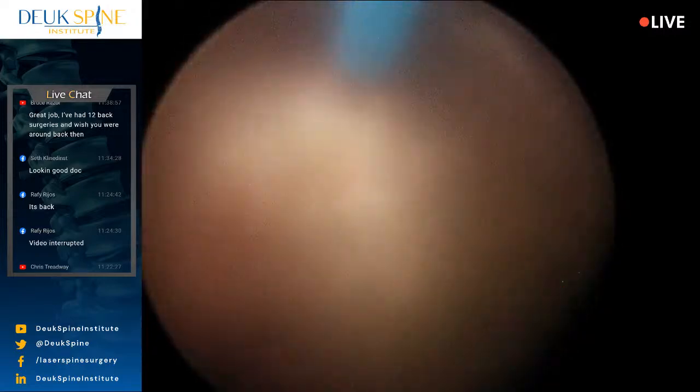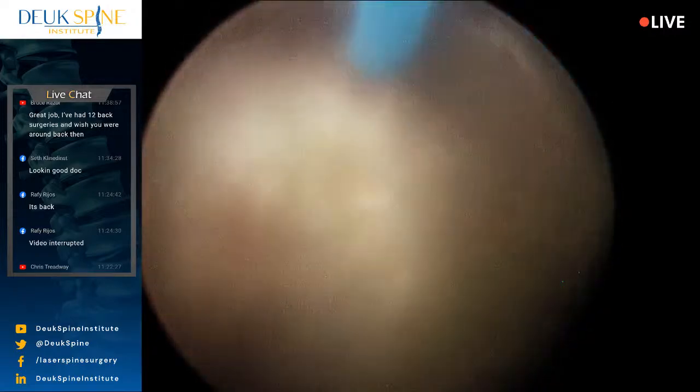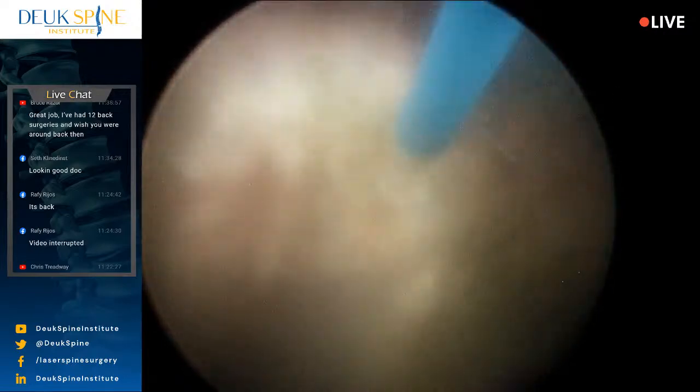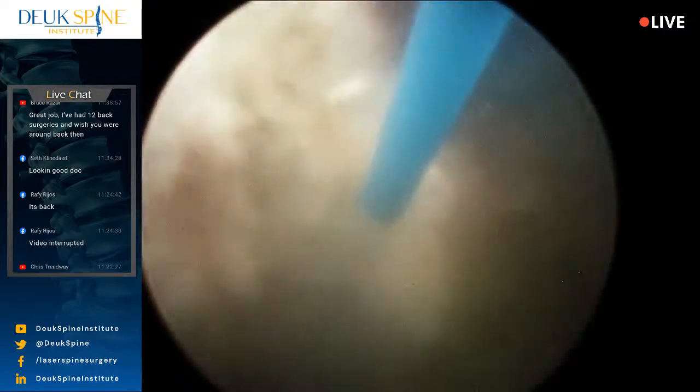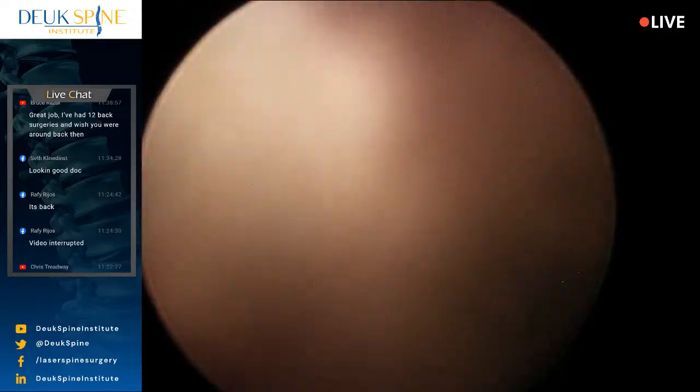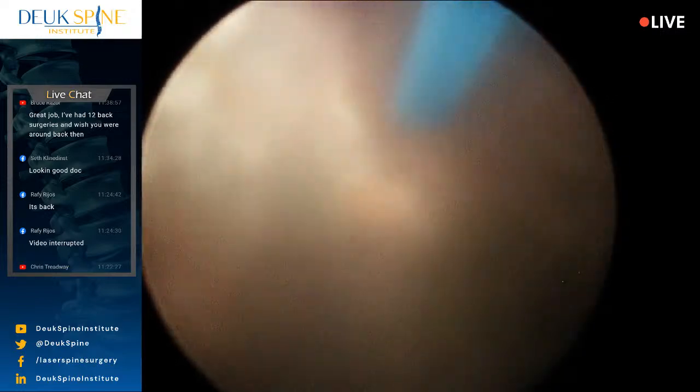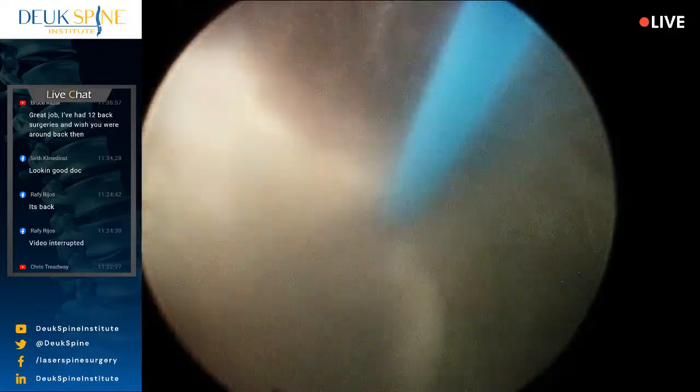The PLIF, the recovery is going to be about 3 months. So think about that. Because this is a tiny incision, we're not doing any damage to the spine. So the body heals very quickly. The only thing that takes a long time to heal is the actual disc. She's responding a little bit.